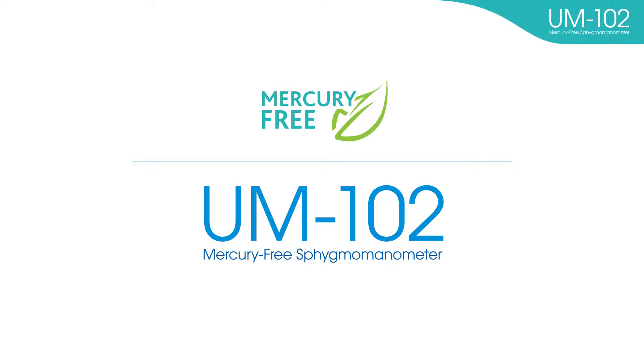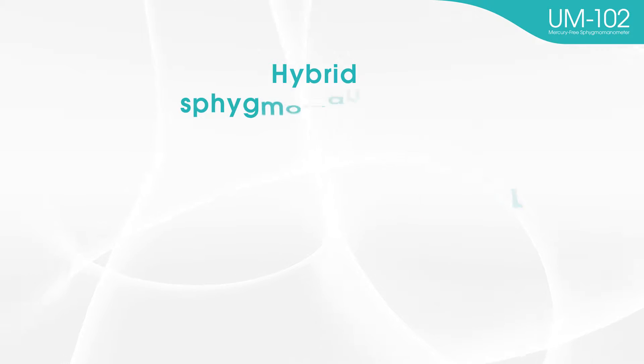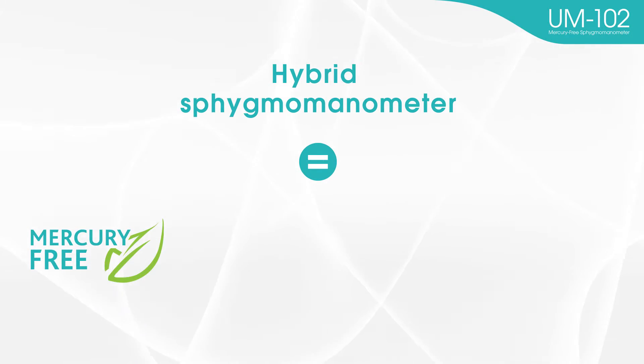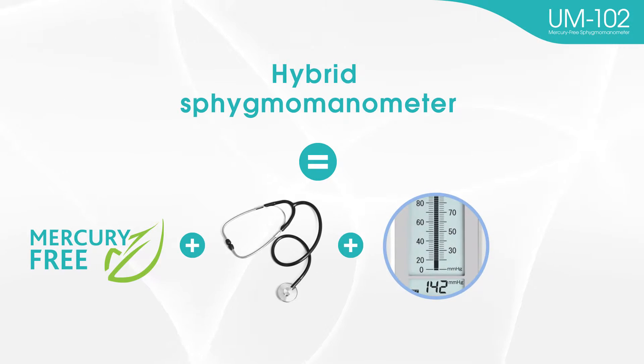Recently, in hypertension societies and medical settings around the world, hybrid sphygmomanometers are being accepted as alternative devices to mercury blood pressure monitors. A hybrid sphygmomanometer is a mercury-free blood pressure monitor with auscultatory measurement and a digital display that is similar in appearance to traditional mercury blood pressure monitors.